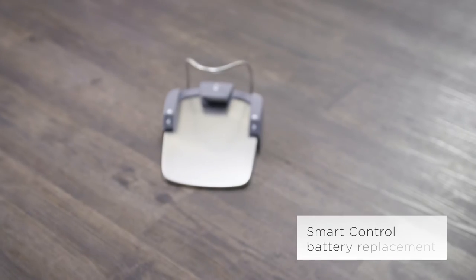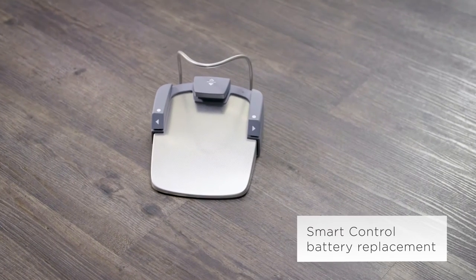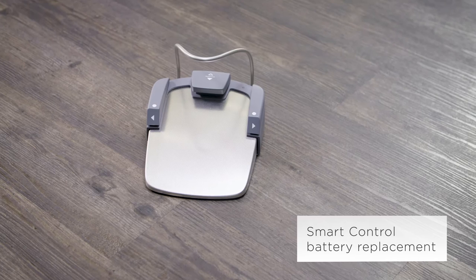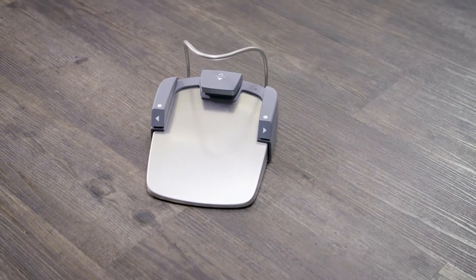In this video, we show you how to replace the battery in the wireless smart control foot control.